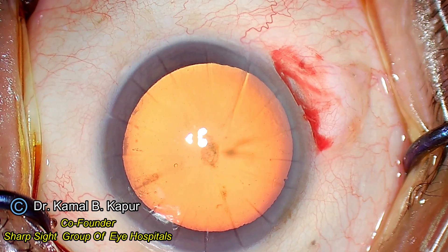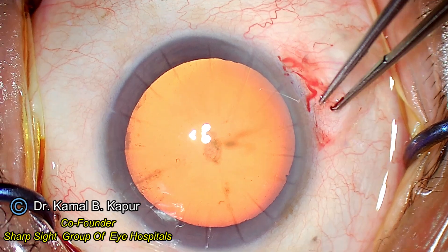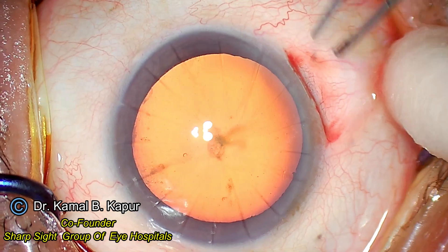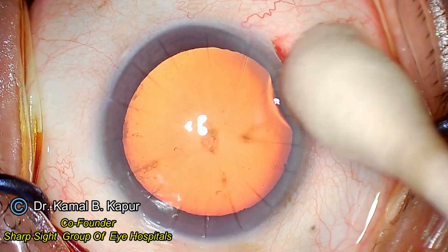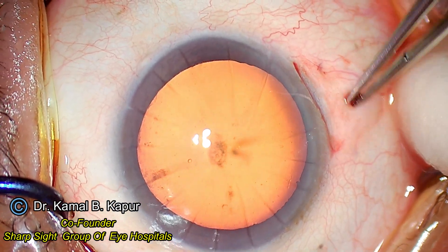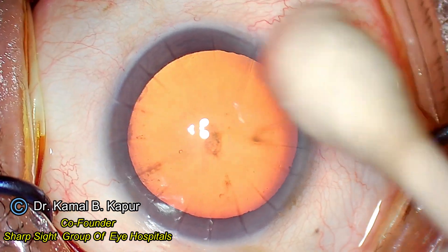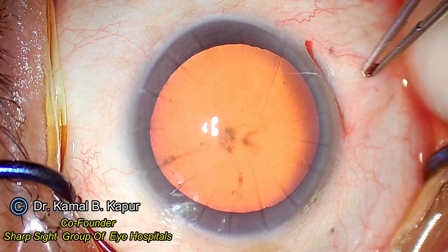Exposure of approximately three to four millimeters of the scleral surface is good enough. Then we proceed to mark the incisional plane on the cornea. But before that, we have to make the globe slightly tighter. So we instill a small amount of viscoelastic into the anterior chamber to make the globe a little tight so that we have more predictable and controlled incisions.